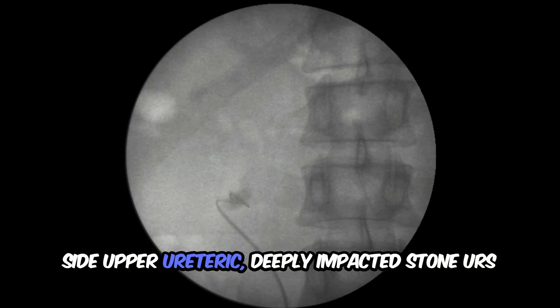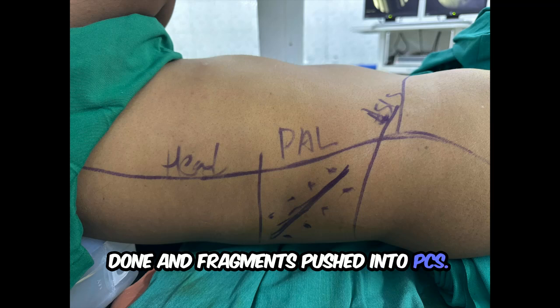Hi friends, Dr. Harsha here. This particular patient had a right side upper ureteric deeply impacted stone, URS done and fragments pushed into PCS.